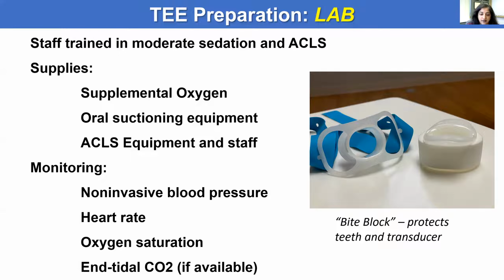These are the bite blocks that we use here in Milwaukee to protect both the teeth of the patient and also our transducer.